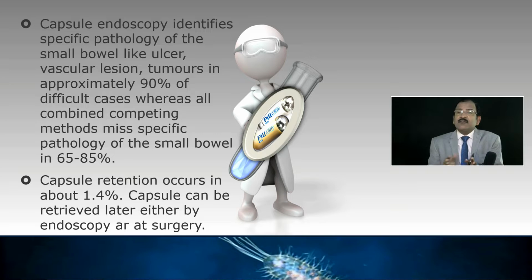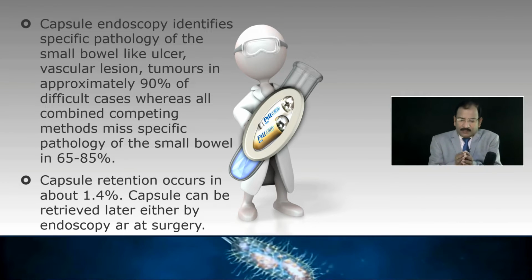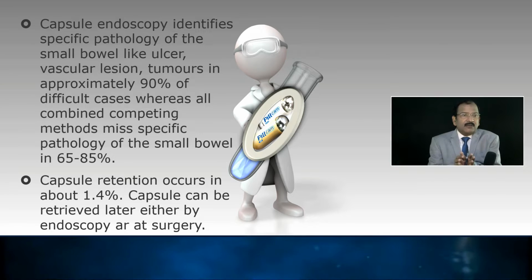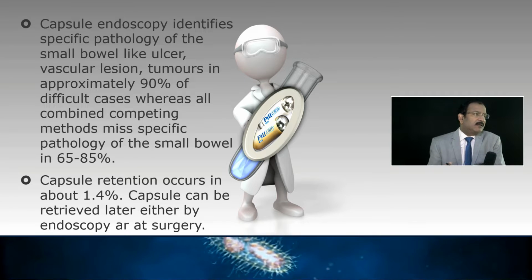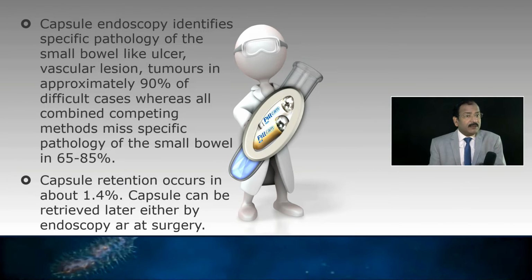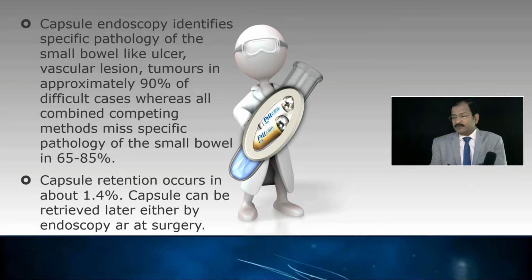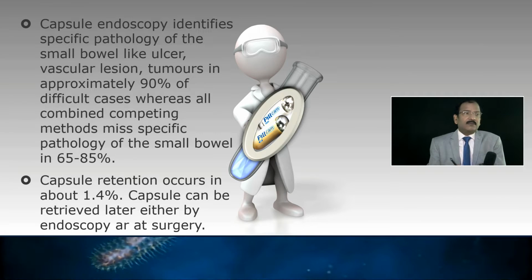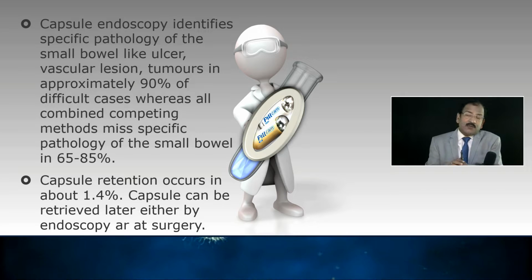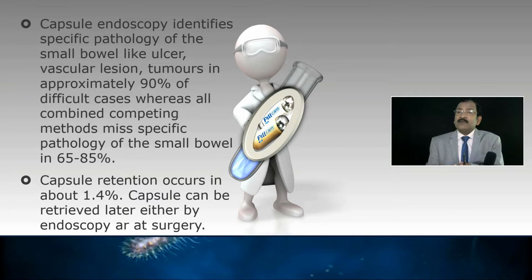here we cannot distend the lumen of the GIT. In conventional endoscopy, whenever you have to diagnose, you can stop, take your time, inflate the bowel loop, have a look, irrigate and suck and clean the mucosa, discuss with your colleague, take a biopsy, and keep your opinion reserved. After 2 days you can give your opinion once you consult some other specialist and show the picture, and that is fantastic. But here it is not possible, because it's a completely collapsed lumen, and you don't have any time to retain. It is just flash photography.